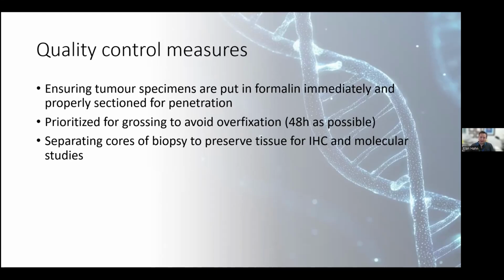And separating cores of biopsy to preserve tissue for IHC and molecular will also help ensure that there's enough tissue and enough tumor cells for testing.